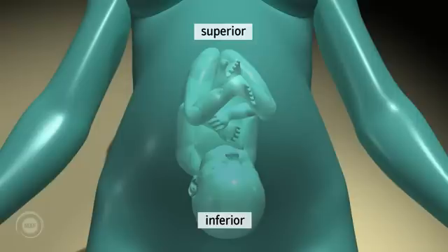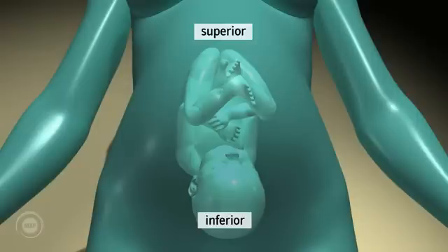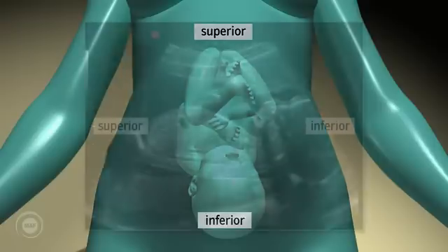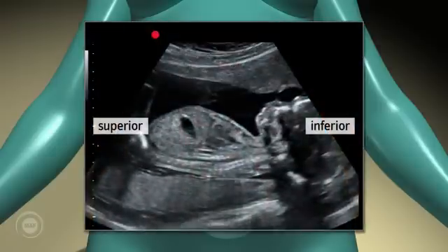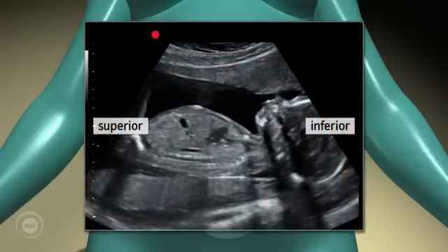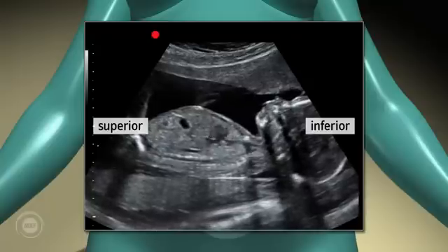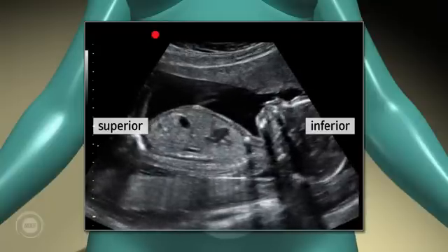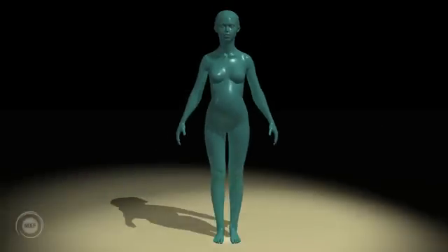Inferior refers to the end towards the mother's feet. As a scan image, superior is represented to the viewer's left on the screen and inferior is represented to the viewer's right on the screen.